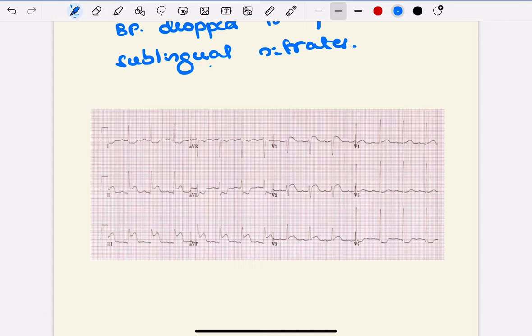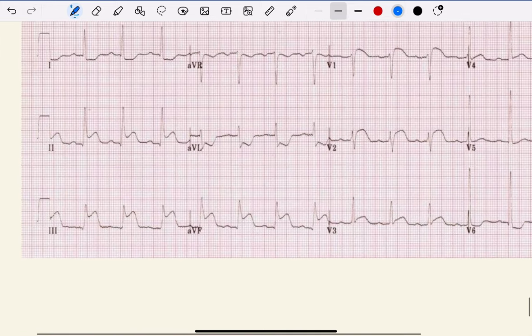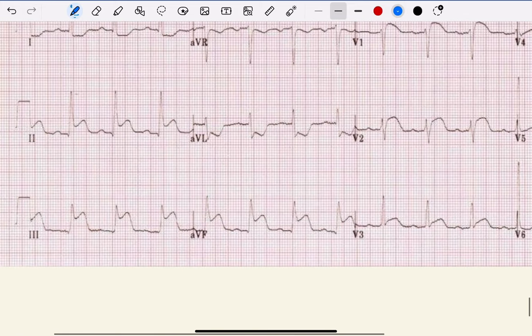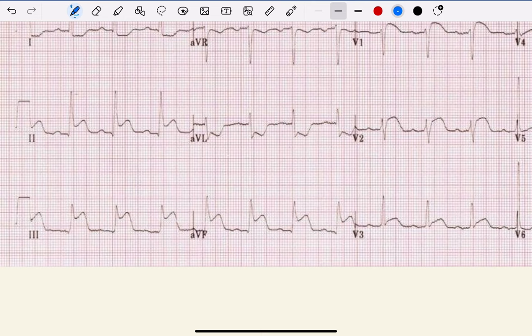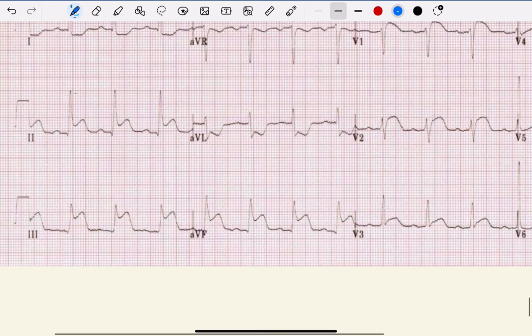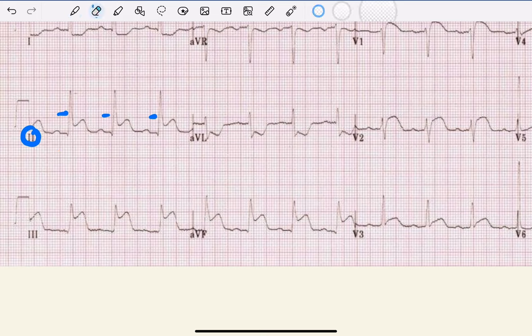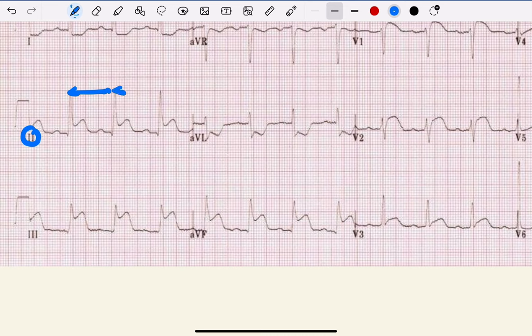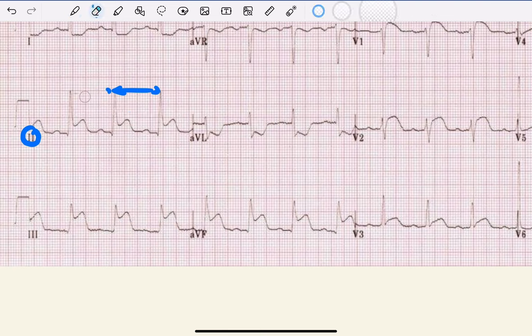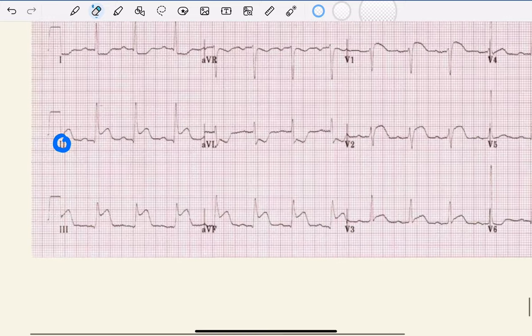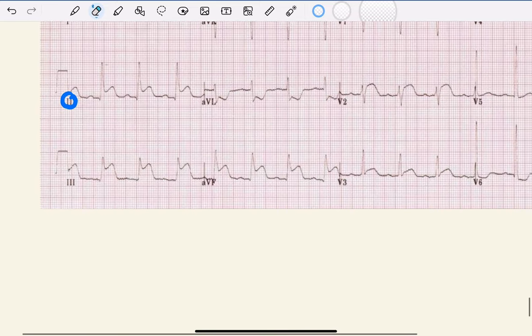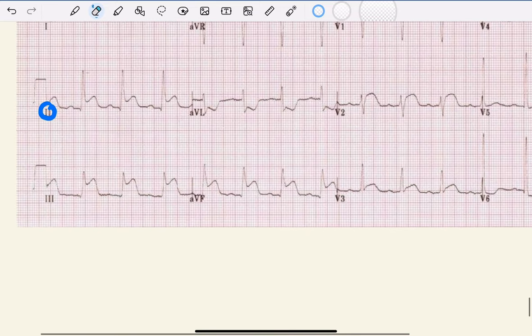Beginning with the rhythm - if you look at the ECG in lead II, there are P waves followed by QRS complexes. All the P waves are looking similar. Look at the RR interval - one, two, three boxes, almost regular. So the given ECG is in sinus rhythm.